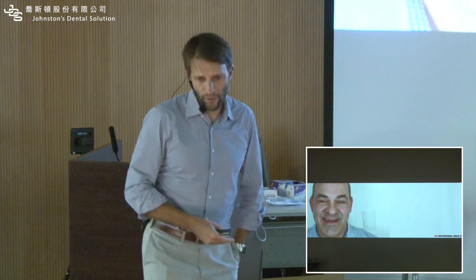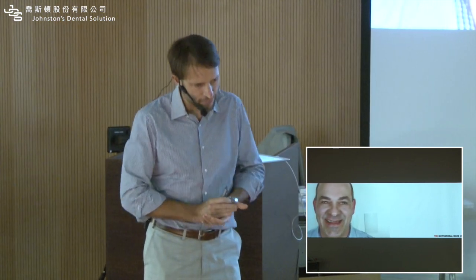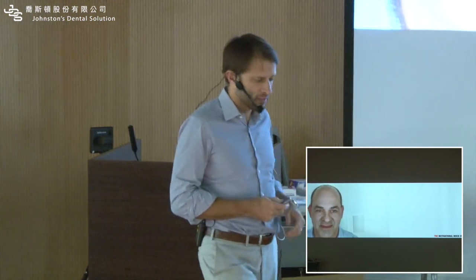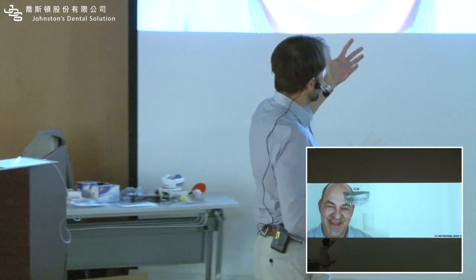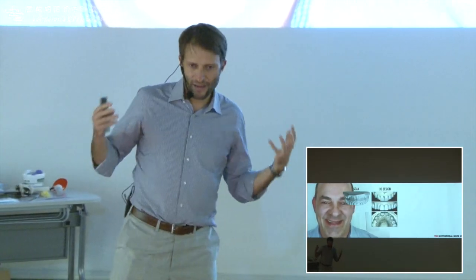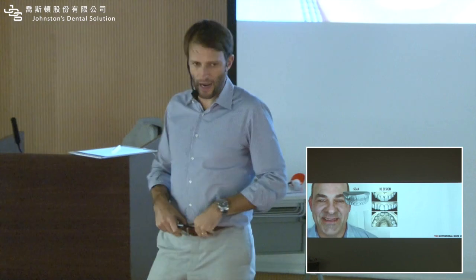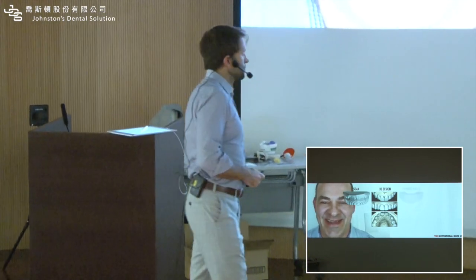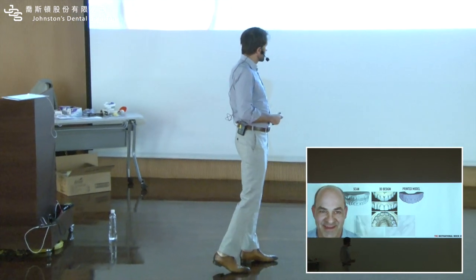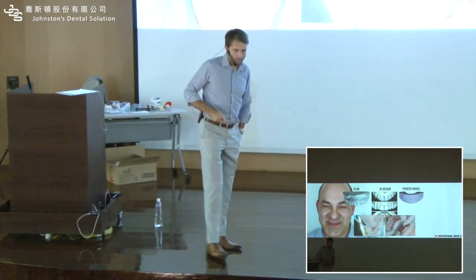You're going to explain to the patient that you have a beautiful plan for them, that you're going to explain this plan in details, but before we explain that, you show the 3D project and you explain the amazing technology behind your plan, and you show them the mock-up model, and you explain them that this can go back into the patient's mouth.